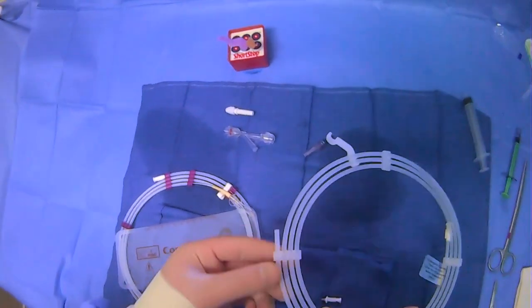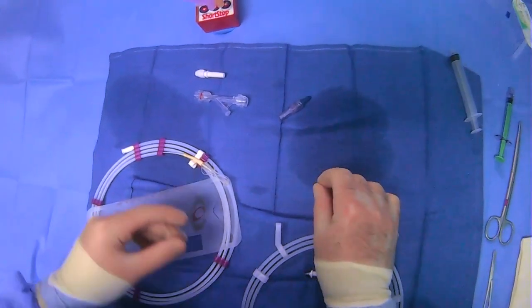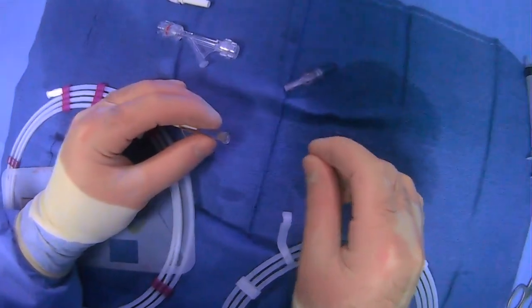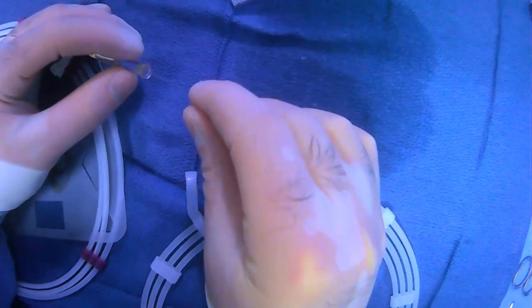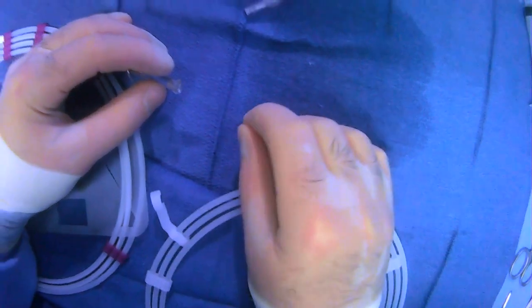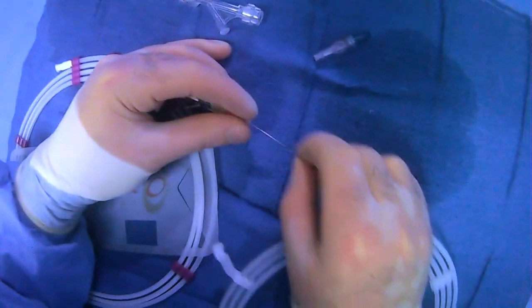Now we can load. When working with microwires and microcatheters, I'd recommend loading while they're both still coiled up — it's a lot simpler and easier. So what we're going to do is load our wire into our microcatheter like so. We'll load it in as much as we can and keep an eye on the other side to see if it comes out.